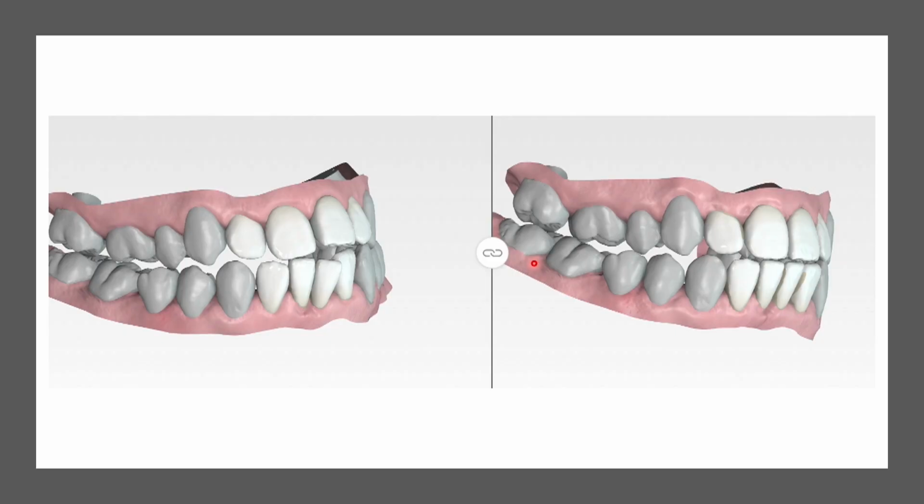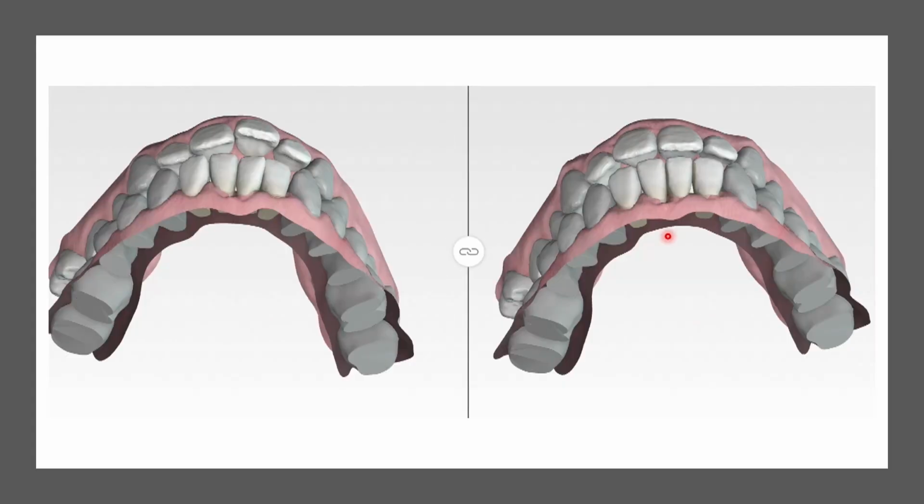The patient was very accepting of that. So we're aiming for an improvement here using some simple aligner moves. By the way, this could only have been delivered with clear aligners because, of course, brackets and wires would have moved everything at the back here. And that's it. Sorry, this is a nice view. Actually, you can see the closure of that tooth down here. That there is a really simple move. This one is probably the hardest move in the whole plan. Actually, it's the rotation of this tooth here.